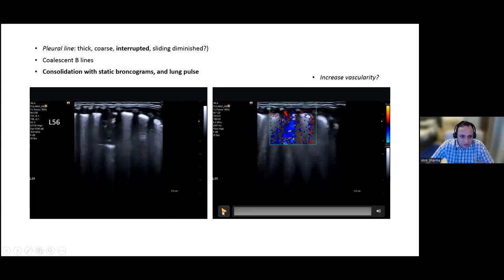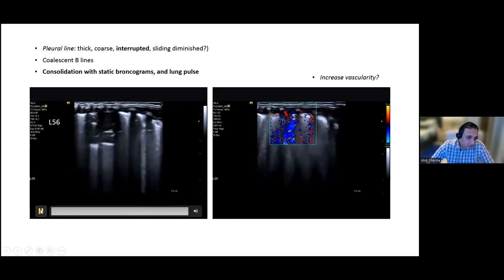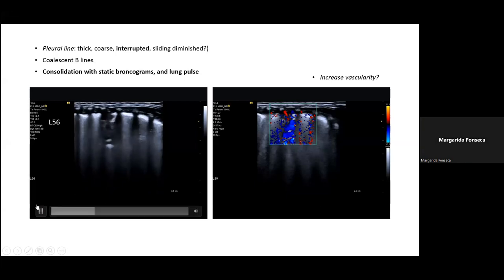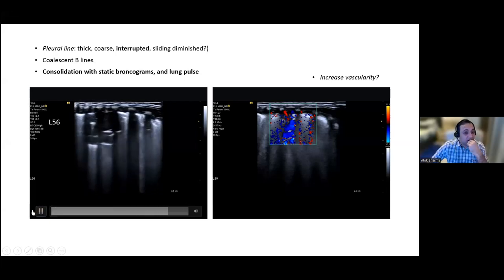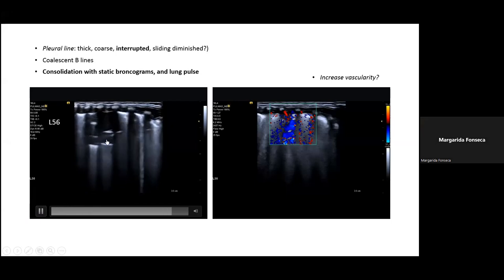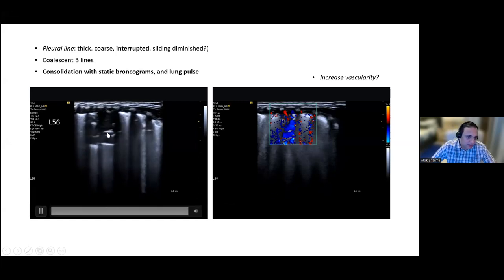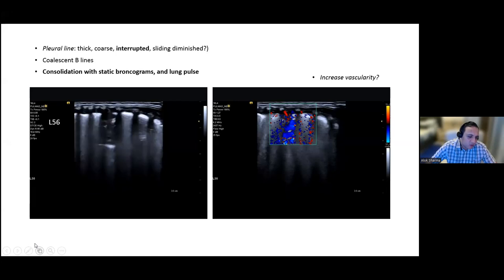The pleural line in the middle is not established, but I would agree it's very irregular. But then you've got these static air bronchograms down here, and they're parallel. Can you see how parallel they are? There's a lung sliding also, a lung pulse here, I think. So the question I'm really asking is, is that an area of atelectasis? Probably. It's also because of the nature of the air bronchograms: they're parallel to each other, not punctate. Again, you can never be completely sure, and differentiating a shred sign in this situation can be incredibly challenging. For me, the important thing is I cannot see a pleural margin there at all.